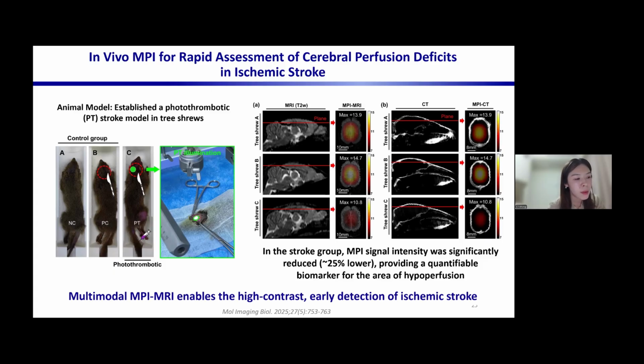And we believe this complements the structural information provided by MR. And currently, many leading groups in the US and in Germany are also developing functional brain imaging techniques based on the cerebral blood flow. So we believe that brain imaging, or functional MPI, will also be one of the most important future directions for MPI technology.